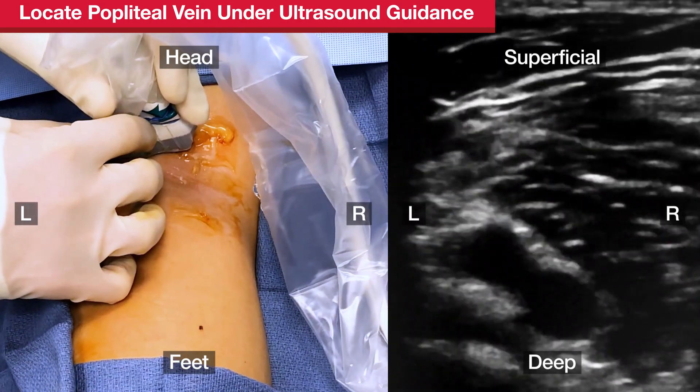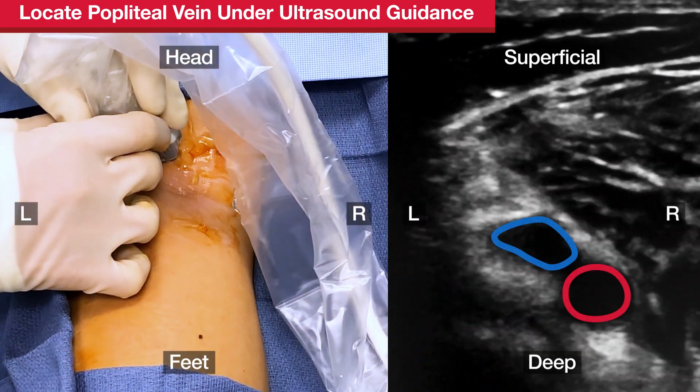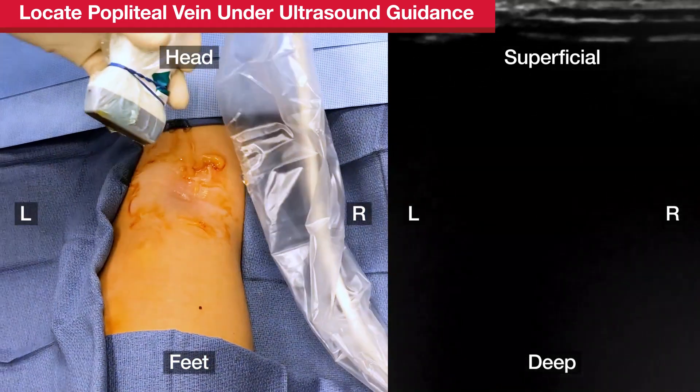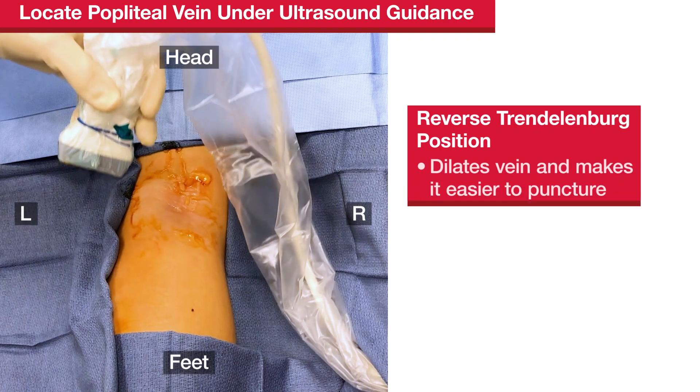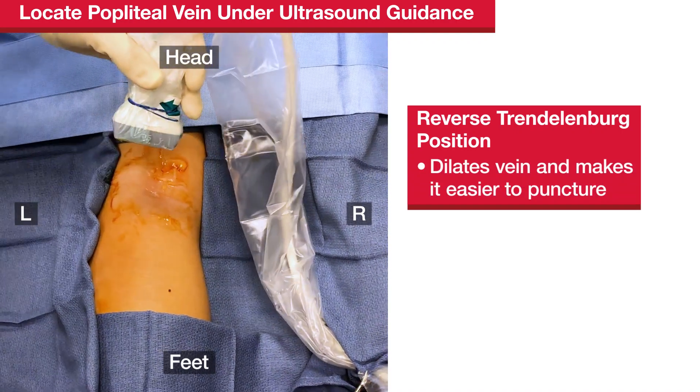As seen in the ultrasound, the ideal site is where the vein is next to the artery, but not above or below it. This reduces the chance of injuring the artery when puncturing the vein with the micropuncture needle. It can be helpful to put the patient in slight reverse Trendelenburg position to dilate the vein and make it easier to puncture.